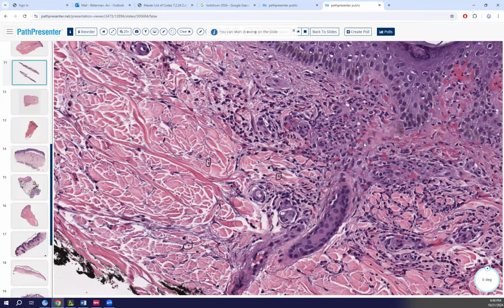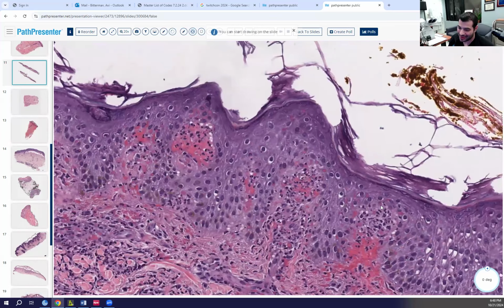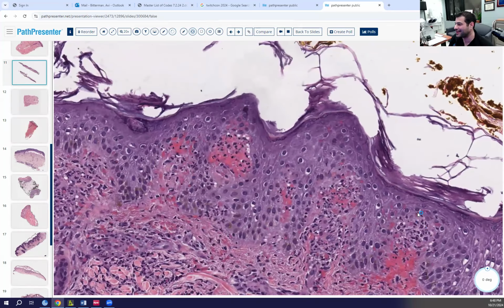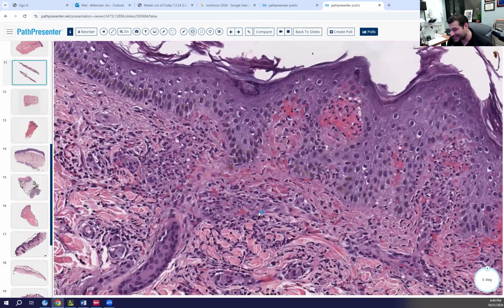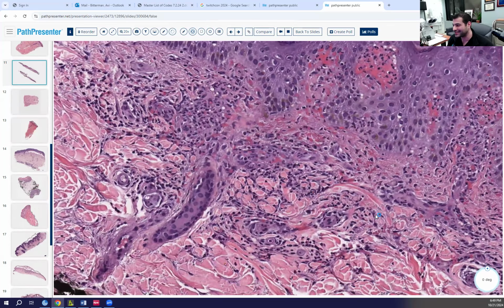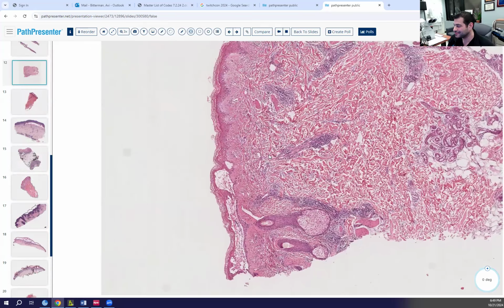This is LCV. I don't know if they still test this fake out, but supposedly you may get a fake out like this where they have neutrophils stuffed in the papilla and you're going to be like, oh my gosh, DH, right? But don't forget to check the rest. The reason there are neutrophils in the papilla is because of neutrophilic dust and extravasated erythrocytes, because it's LCV.